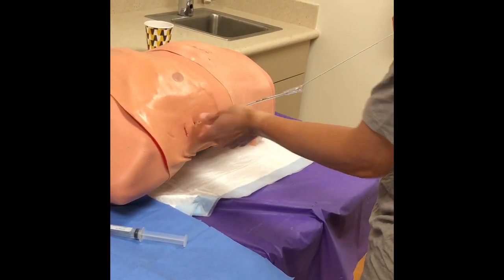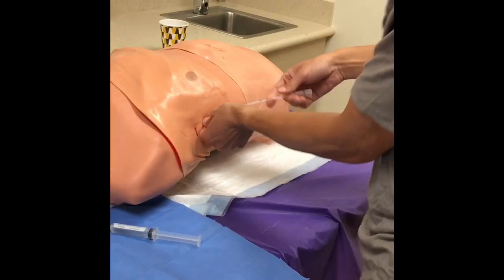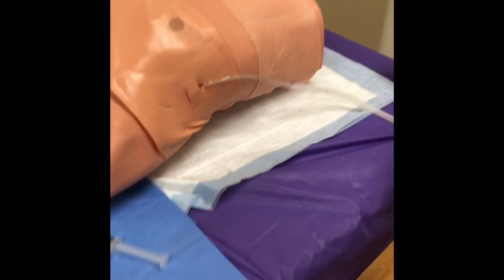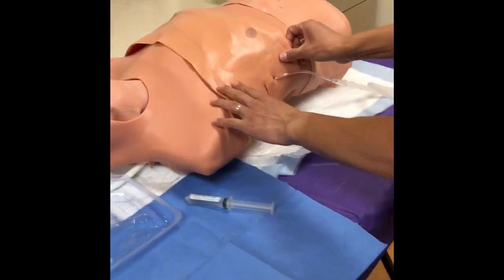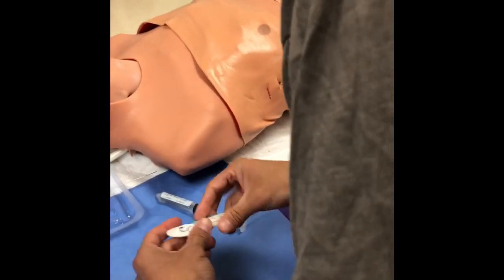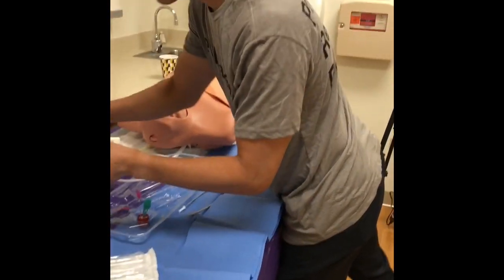Remove the guide wire and the last introducer, then hook the tube up to the pleur-evac. Check for respiratory variation in the pleur-evac — that's covered in a different video. The most important part now is securing the tube so it doesn't fall out.